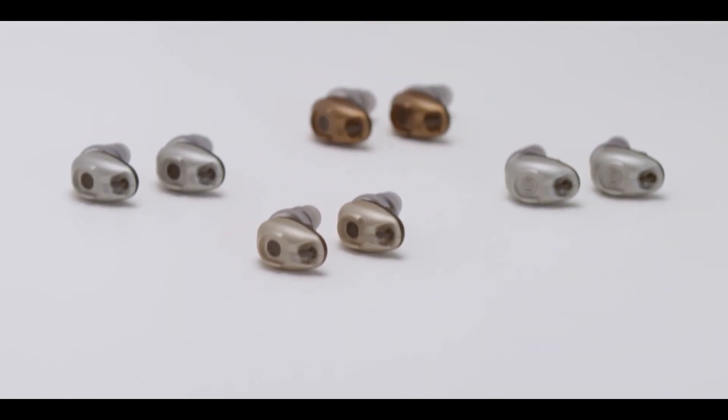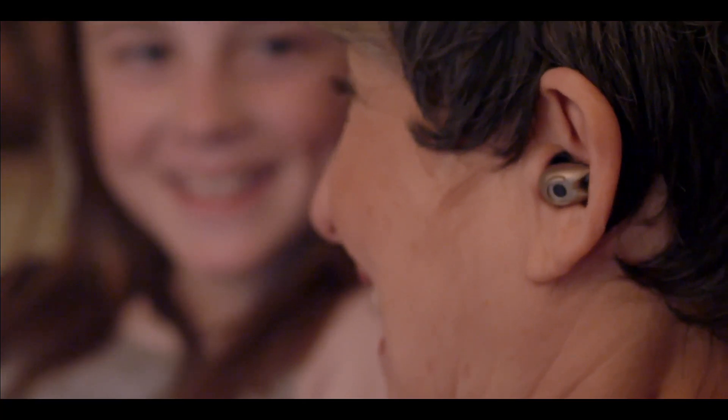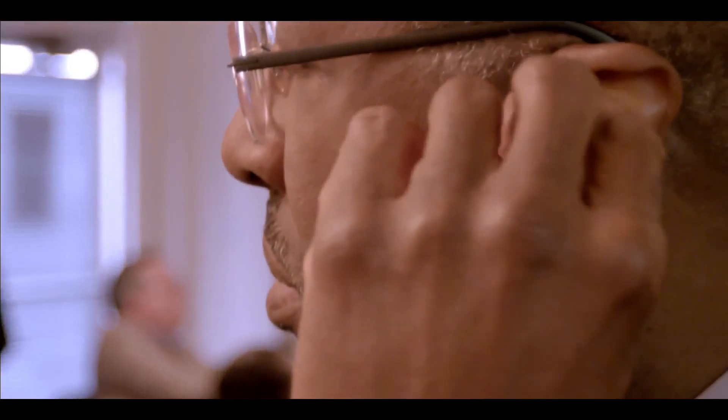The Bean from Etymotic Research is a personal sound amplifier. Unlike a hearing aid, it does not require multiple visits to a licensed professional. Instead, it can be purchased without a medical referral and is ready to use right out of the box. It provides an affordable do-it-yourself solution similar to reading glasses.